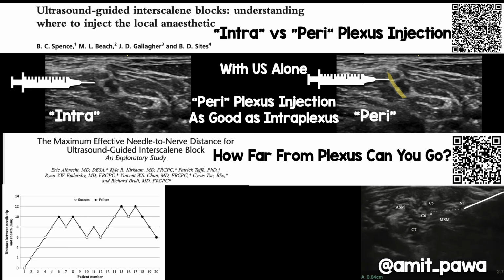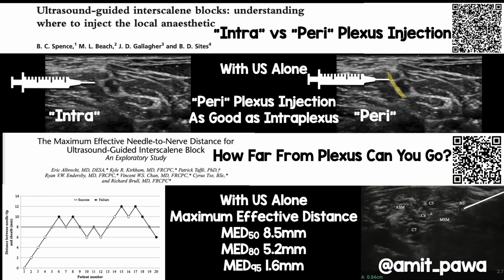There was another paper here that took that whole concept a little bit further. They started off doing a periplexus injection, and every time they got a successful block, for the subsequent block, they brought the needle back a bit and then performed the block. And again, if that block was successful on the next patient, they brought the needle back even further. And what they determined was using ultrasound alone, the maximum effective distance for a 50% success rate was actually 8.5 millimeters away from the nerves in the interscalene groove.